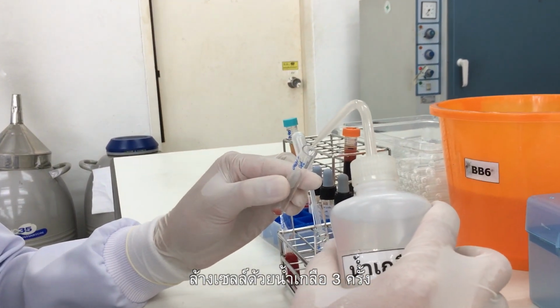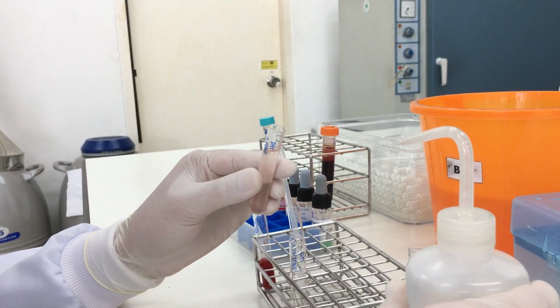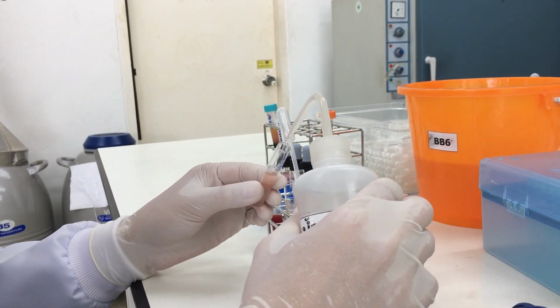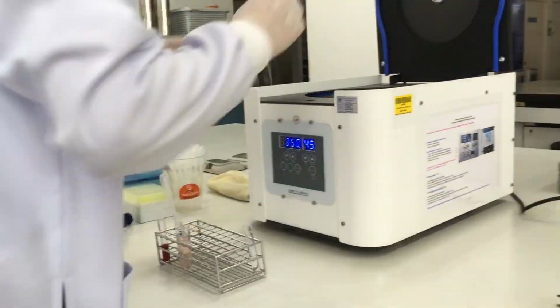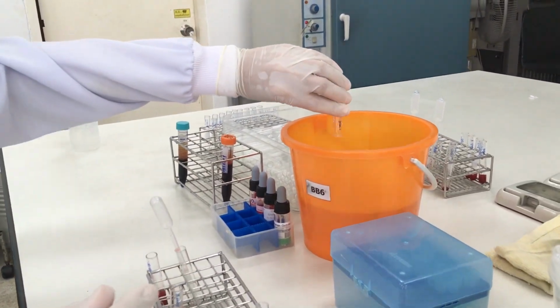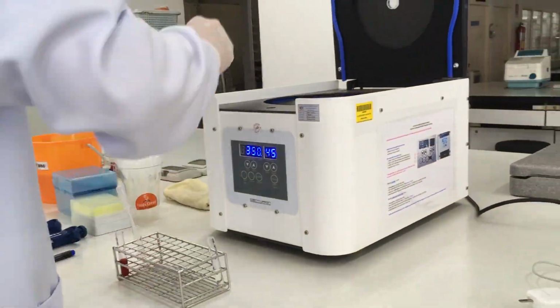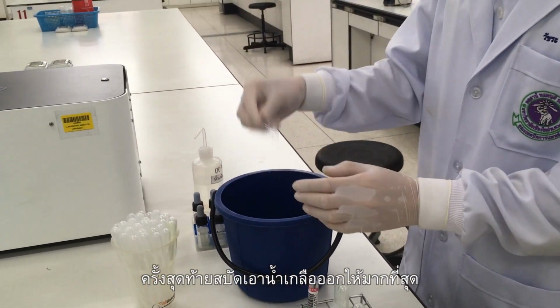Wash 3 times with normal saline and flick to completely decant the normal saline in the last wash.